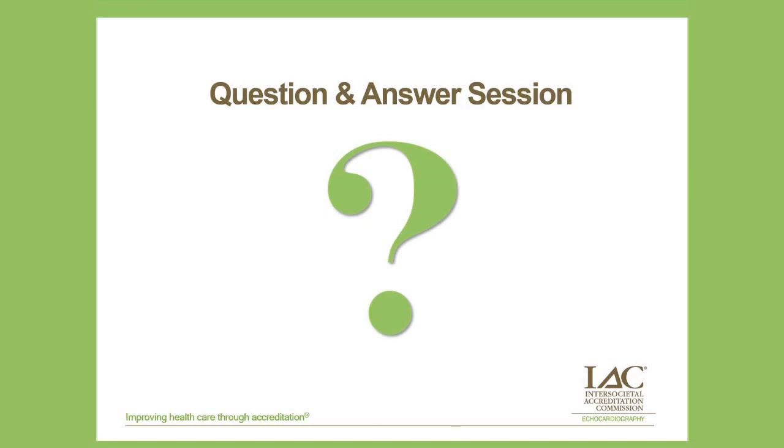Okay, Kelly asks, how do you quantify MR in patients post-mitral valve clip procedure? So it's very hard, and it's one of the hardest things that I do. The two hardest things that I do are quantifying MR after a MitraClip and quantifying paravalvular leak after TAVR. The trouble is that the MitraClip is like sticking your thumb over a water hose. It makes a spray. So the color Doppler jet always looks bad, even if there's hardly any MR. And there have been some studies of magnetic resonance imaging showing that people with these big MR jets after a clip have a regurgitant volume of 10 cc's.